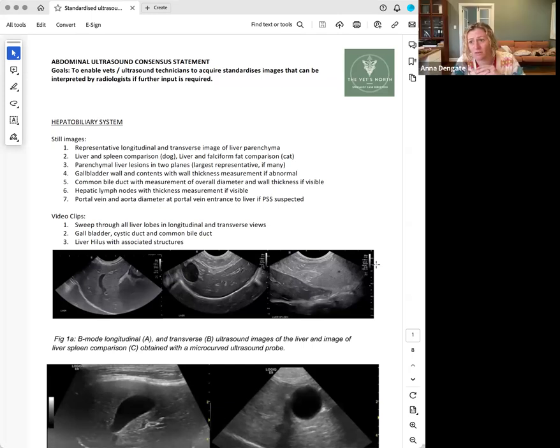Portal vasculature was very subtle because the dogs that have the best outcomes for surgery are the dogs that have still got quite good portal flow, but there's also a shunt. So in the best outcome dogs, the liver actually looks pretty normal, maybe a tiny bit small, but often too subjective to make a call on. So if there's any doubt whatsoever, even if there's normal liver enzymes, if you find some uroliths, then I reckon it's worth doing that portal to aortic ratio just for a little bit of added evidence, and putting in your recommendations a bile acid just to rule out, particularly if it comes back as urate.